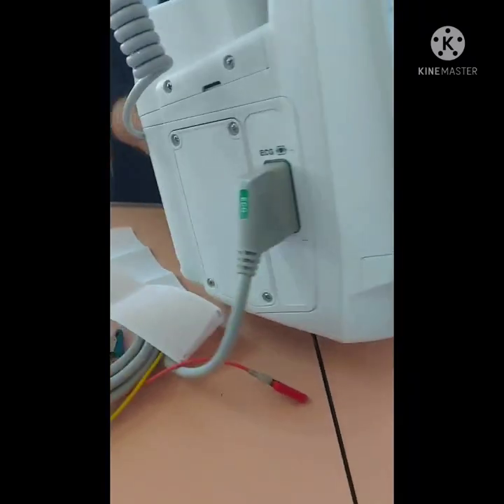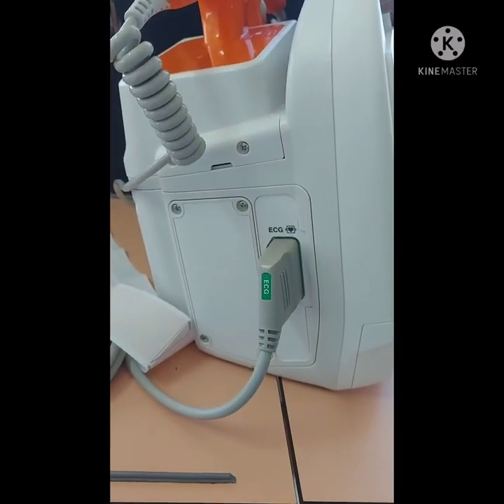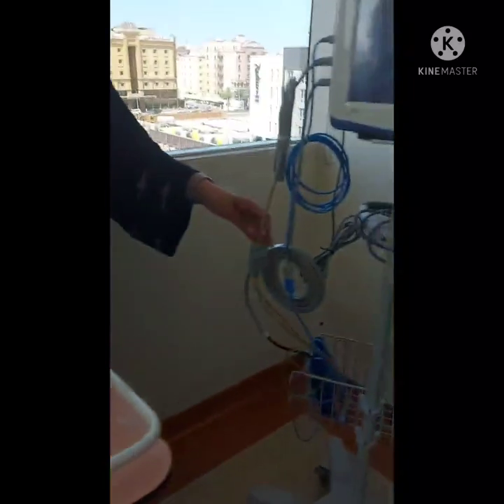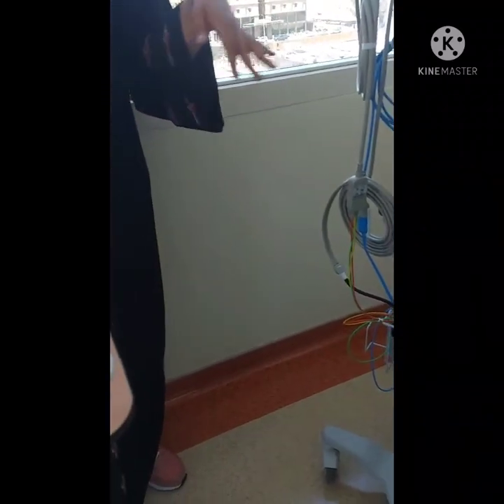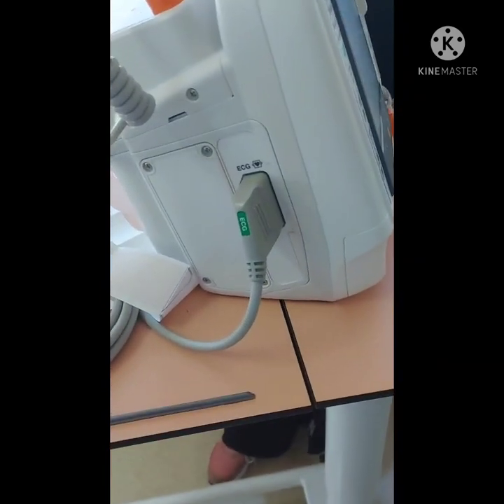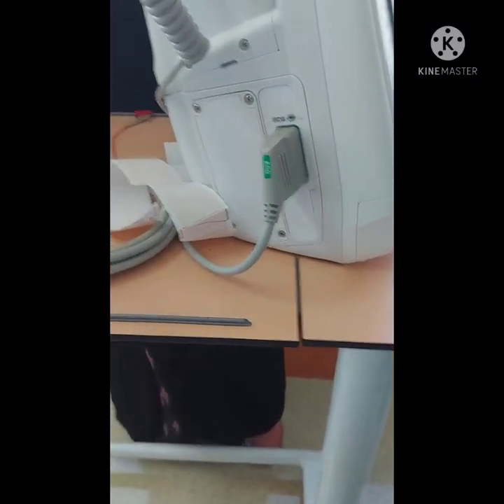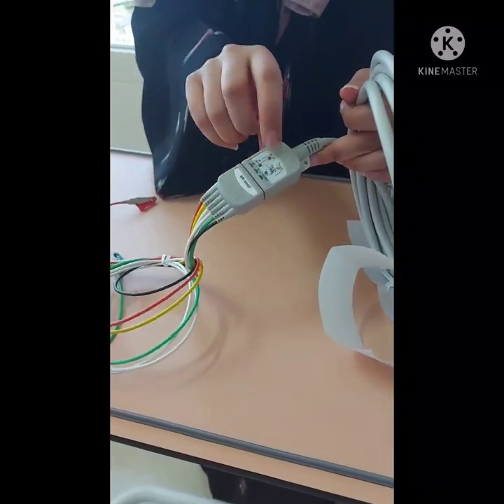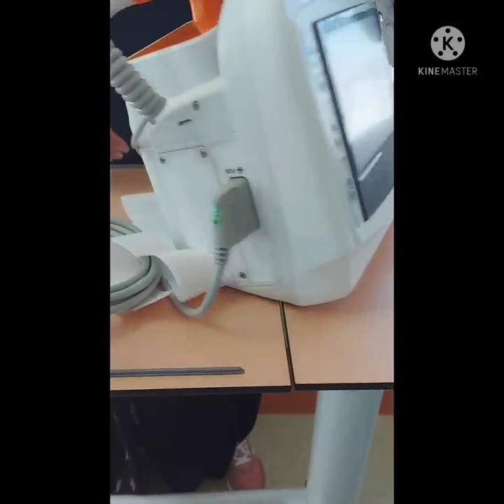From the other side here, you have the ECG cables. For the ECG here, you have the five or the six, and here you have the three, so you can just mix and match. If you want the three here and the six here, you can just remove it and put it, because our adapters are universal, so whatever you remove from this, you can attach to this. Okay, here, this is the ECG adapter and this is the ECG leads, and here also you have the colors for the attachment for the patient. You will see it also in the monitor itself. It has a manual guide.